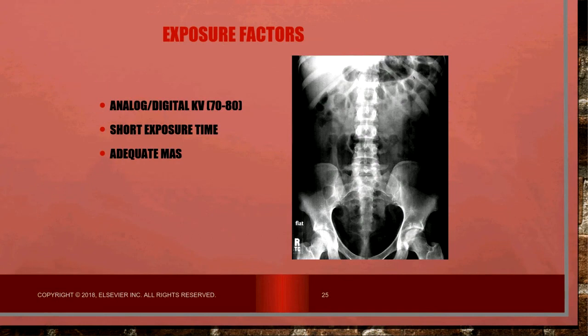And as far as our obese patients, this is where typically you're going to have to do at least 2 images crosswise to each other, or the potential is there where you might have to actually do 4 images and label them as quadrants, meaning you would do a right upper quadrant, right lower quadrant, left upper quadrant, and left lower quadrant. That is a very likely possibility on obese patients. And we will look at that in lecture when we discuss that in just a few minutes.